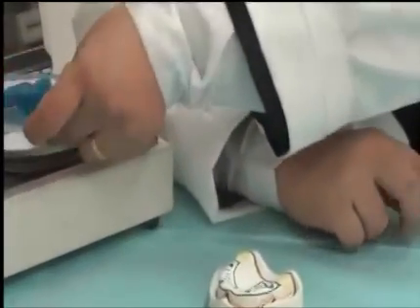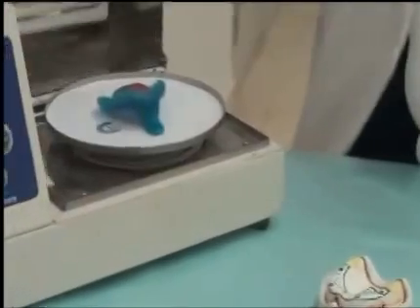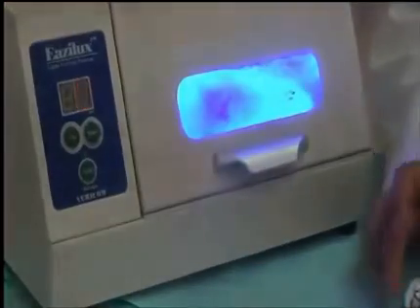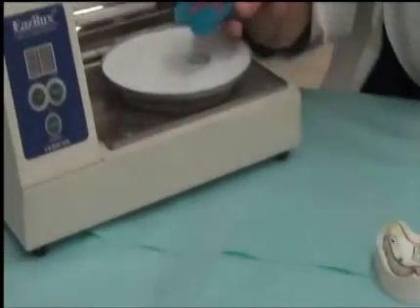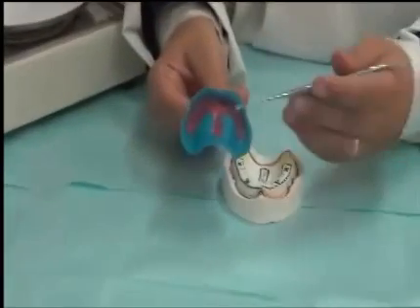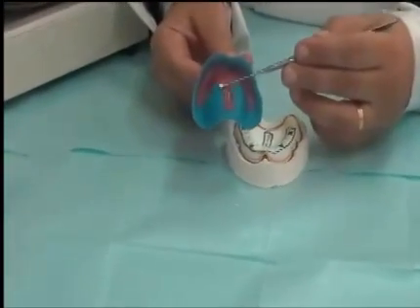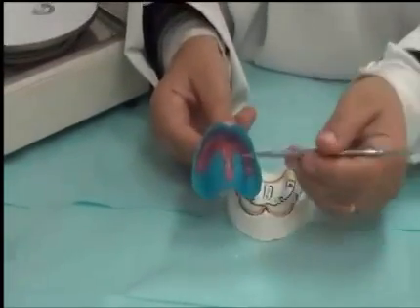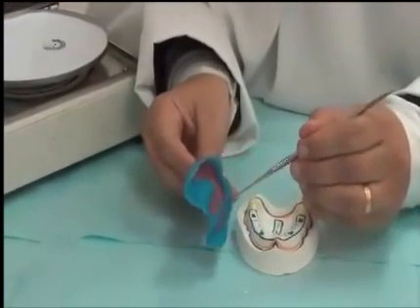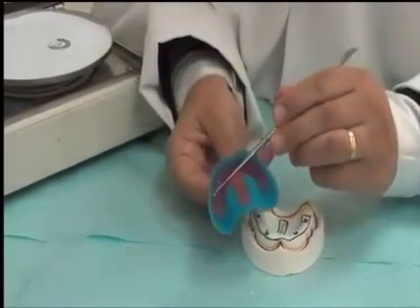So we are inverting it from the other side, and we're doing a second cycle of curing. Once removed from the light cure, we find that wax is embedded inside our tray. The tray material covers all of the borders, so no wax is exposed to the borders.